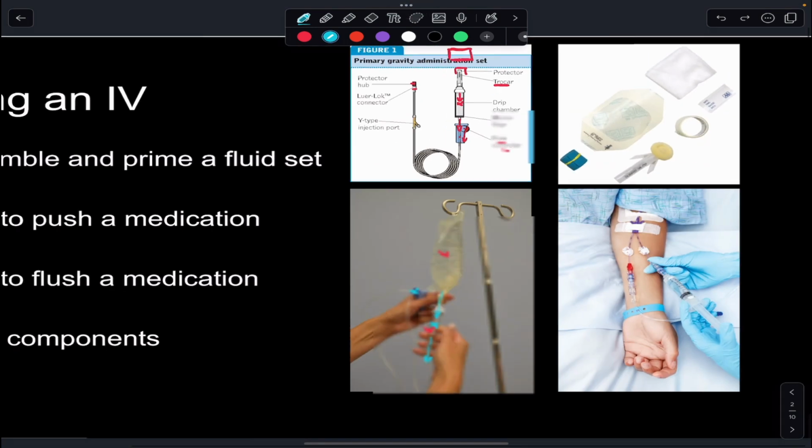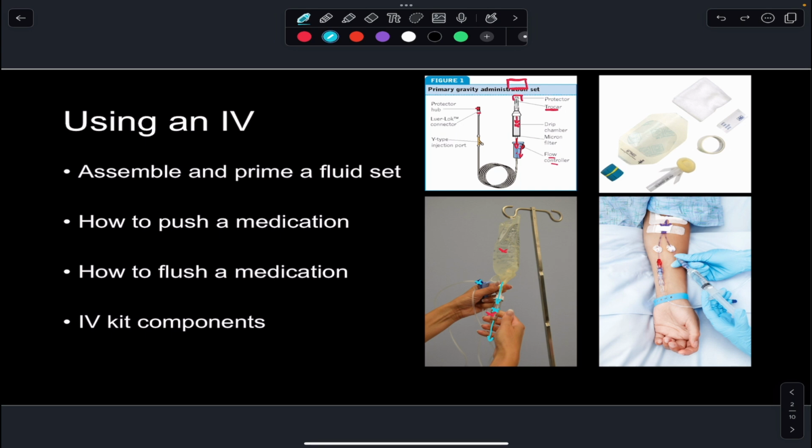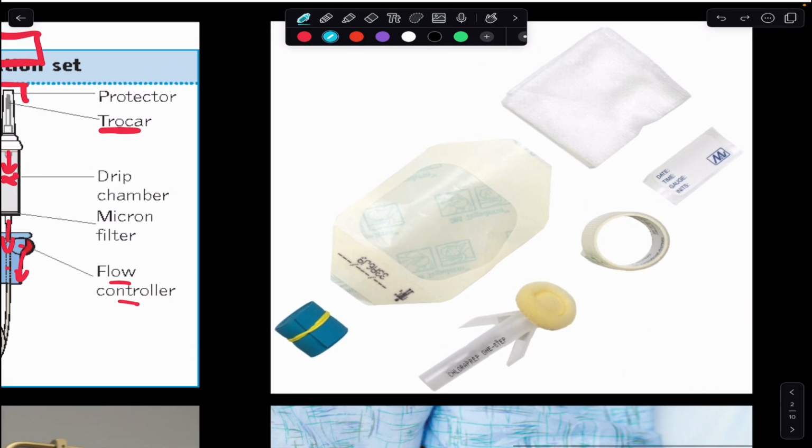Finally, we're going to discuss the different components of an IV kit. So you've got to a point where you've assembled your fluid bag, and then a nurse says, hey, do you want to start an IV? And you say yes. So you'll grab your assembled fluid bag, you'll grab an IV needle and catheter, and you'll grab an IV kit. What you'll find in the IV kit are these components. So you have a tourniquet, you have a Tegaderm, some gauze, some labeling equipment, tape, and then disinfectant.